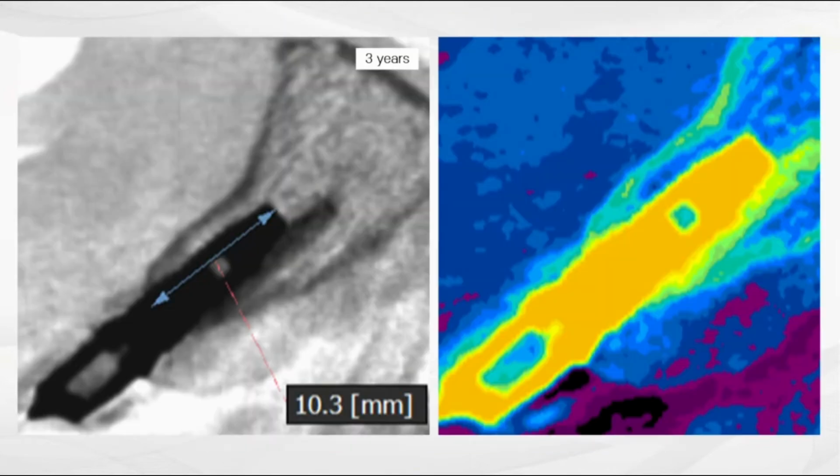3 years later, photos show the labial cortical bone was well created, so the border of the defect over the labial side of the implant fixture completely disappeared. The volume and quality of the cortical and cancellous bone complex are well structured as well.